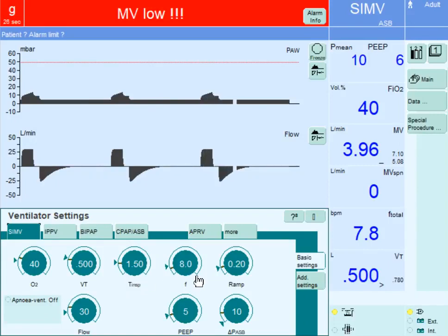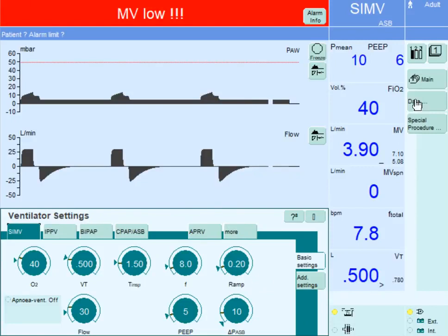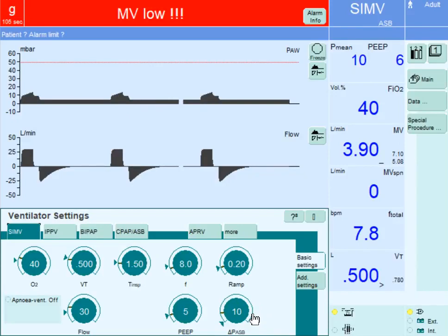The rate is set at 8 breaths per minute, indicating that the trigger is time every 7.5 seconds, which is 60 seconds divided by 8. We have a positive end-expiratory pressure at 5 centimeters of water. The ramp or slope — the rise of the pressure support — is set at 0.2 seconds, meaning it will take 0.2 seconds to reach the maximum pressure support of 10 centimeters of water set for spontaneous breaths.